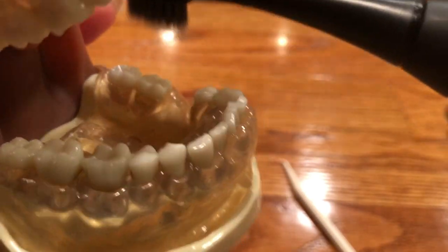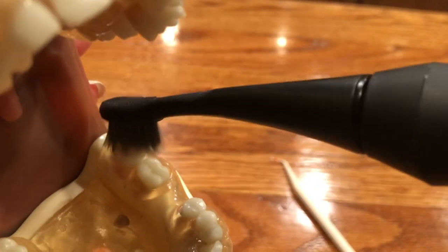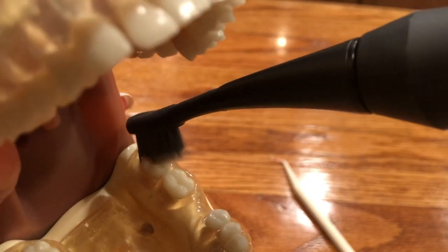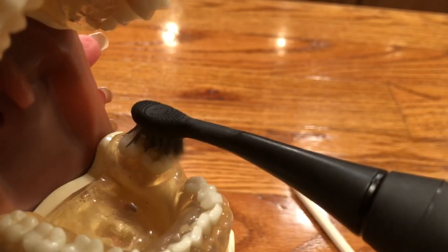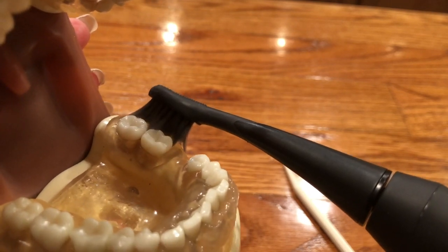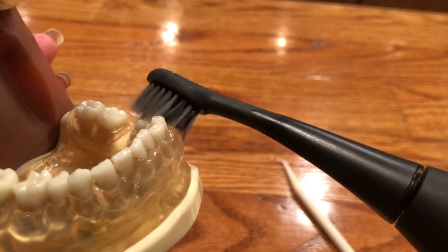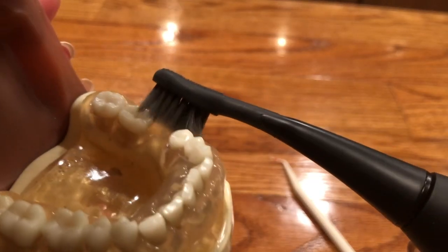And you can see when you get to the inside, if you're trying to get the back teeth and you have pockets on the back, sometimes it's better to come over the top this way to get the back side of the tooth, and then just turn to get the insides or turn to get the outsides. You saw that little pause. Every 30 seconds this Burst toothbrush pauses to let you know now it's time to change to the next side. So you should take about 30 seconds to go along the outside here, 30 seconds on the inside.